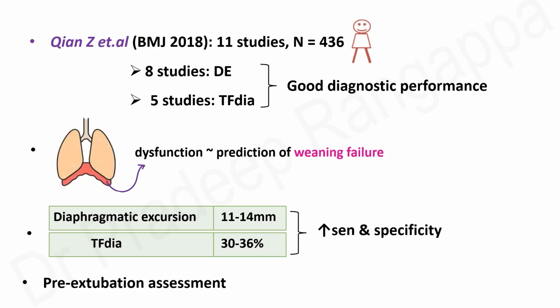So this is a brief overview of diaphragmatic assessment in the ICU. But one important message to all the listeners is that assessing only diaphragmatic function as indicative of someone who would wean is something that one should not do. This has to be combined with assessing your cardiac function and other weaning parameters, SBT trials, and so on and so forth. So this is used mainly as an adjunct to the other weaning indices to ascertain that effective weaning and extubation could happen successfully.